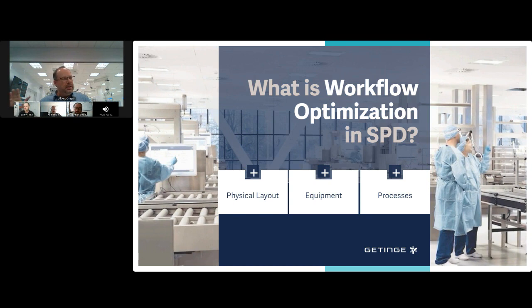So when the OR is typically, you look at their slate and you see when the peaks and the valleys are, and your equipment has to be able to meet those peak level demands. And like I believe Andy mentioned, you don't want to create bottlenecks due to lack of proper equipment. So it's essential throughout the reprocessing.